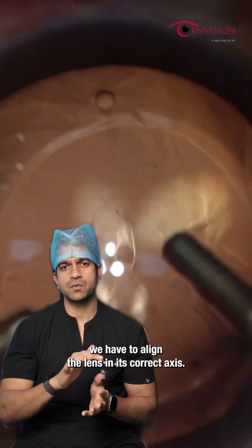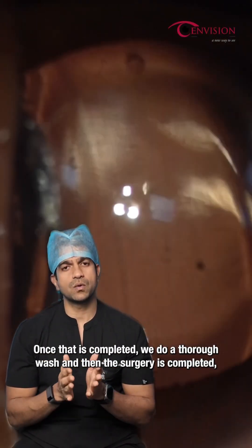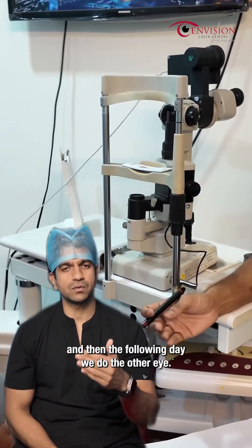Once the lens is placed in position, sometimes if it is a toric lens, we have to align the lens in its correct axis. Once that is completed, we do a thorough wash and then the surgery is completed. The next day we do the follow-up for the patient, and the following day we do the other eye.